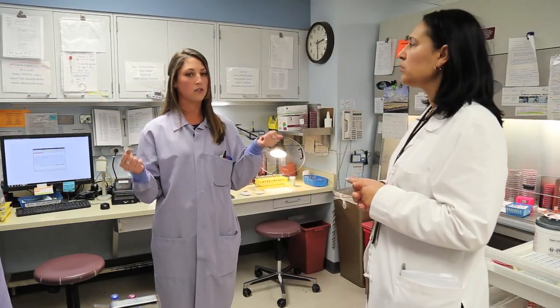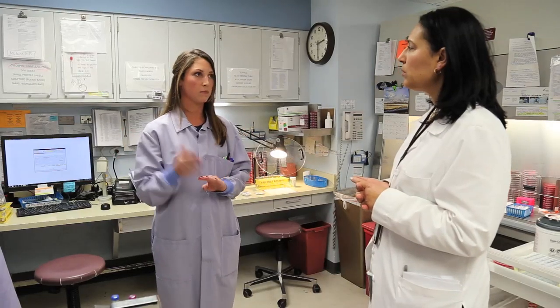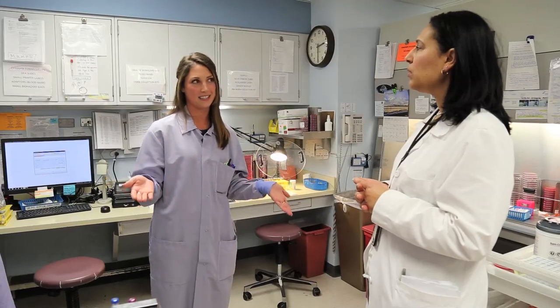Next would just be PCR in general. We have about a 2-hour turnaround time for all of our PCRs. That 2-hour turnaround time is from the second we receive it, not from the time it's collected and they said they sent it to us.